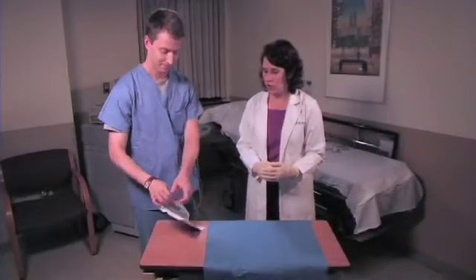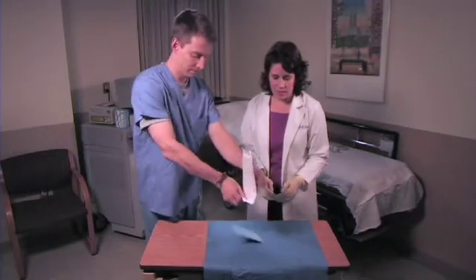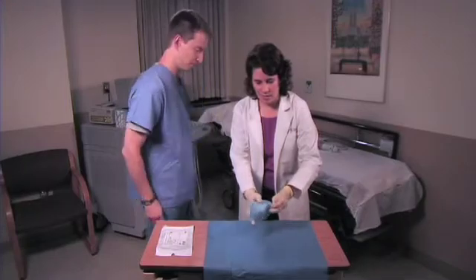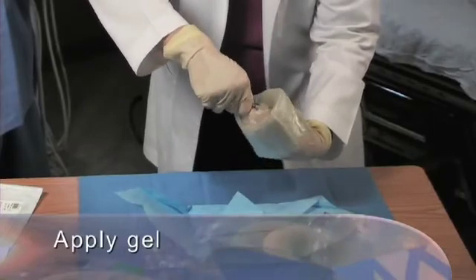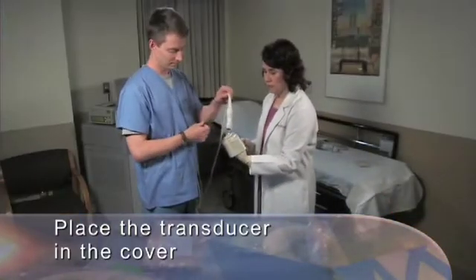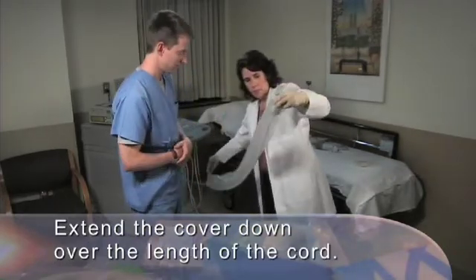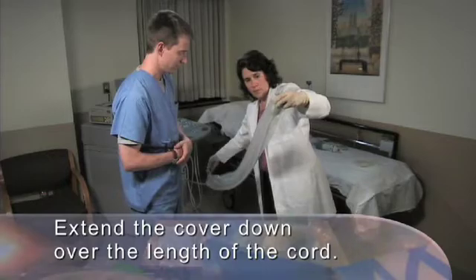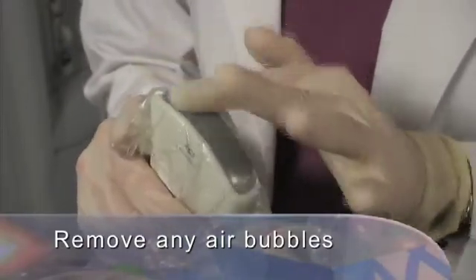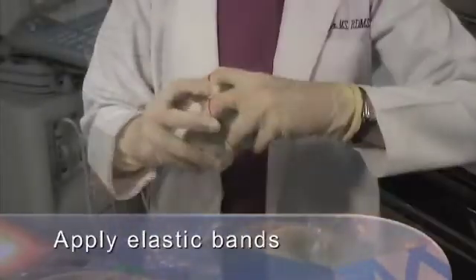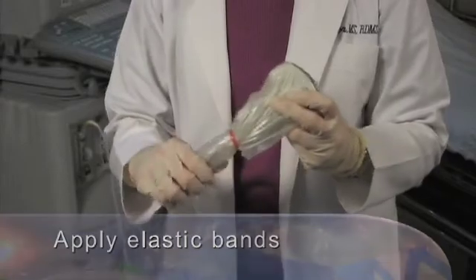Using the dual person approach to applying a general purpose transducer cover, the non-sterile person opens the procedure kit, placing it onto the sterile tray. The sterile person opens the sterile gel packet and creates an opening in the cover and applies gel. The non-sterile person places the transducer into the cover. The sterile person then extends the cover down over the length of the cord, ensuring proper sterile technique. Check carefully and remove any air bubbles that are between the transducer face and the cover. While remaining in the sterile field, apply enclosed sterile elastic bands to secure the cover in place.